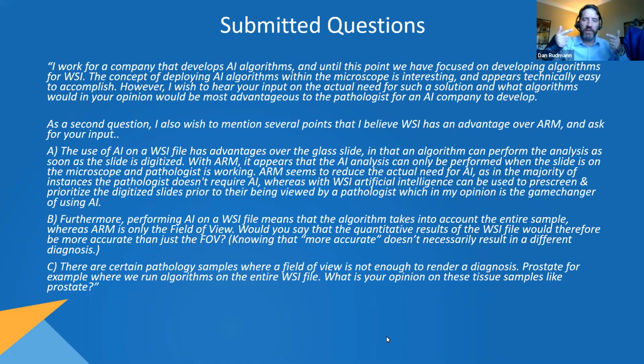As your mind is thinking, it's almost like having another pathologist on a multi-headed scope with you at the same time, but instead of another pathologist, it's a computer. And the basis of that computer is the ground truth of pathologists, right? So it's really a very interesting approach.